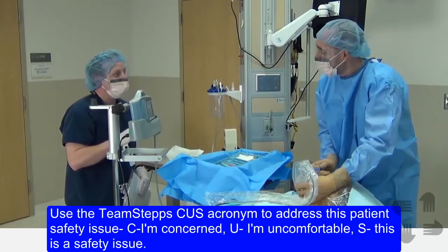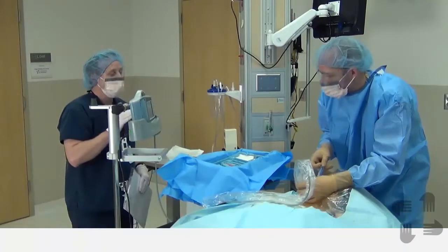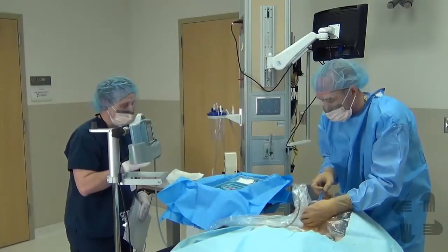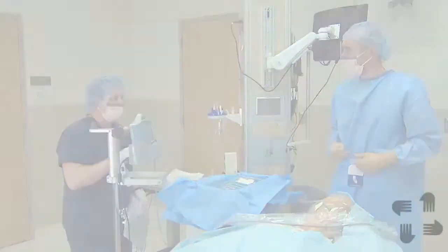Trent, if I need your help, I'll ask for it, okay? This is a tough line. I'm trying to get this. Travis, this is now a safety concern for the patient. We have to stop immediately. Listen, okay, fine. What's your problem? Okay, you broke the sterile field.